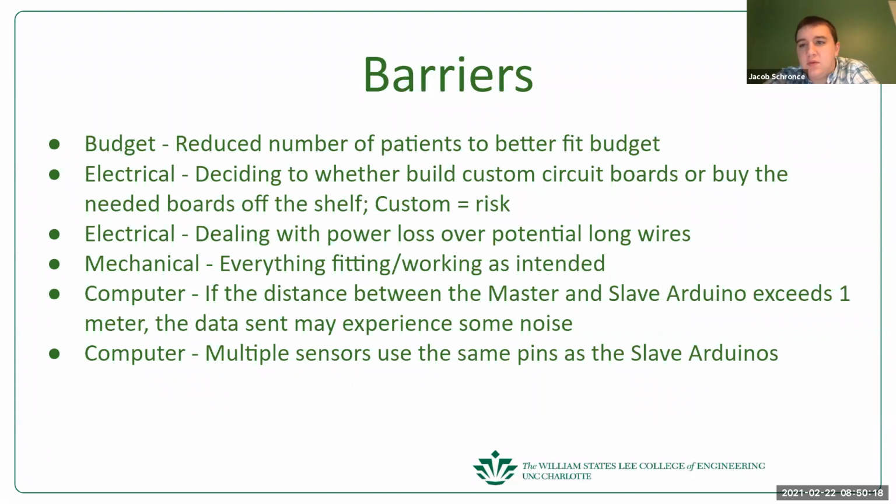And then from the mechanical side, just making sure that everything is fitting together and working together as we intended to do so in the initial design phase. And then with the computer side of things, it's just the distance between the master and the slave Arduino. If it exceeds 1 meter, the data may experience some noise, so we've got to find a way to adjust for that. And then also just multiple sensors using the same pin as the slave Arduinos, which I think Noel addressed pretty well. So.